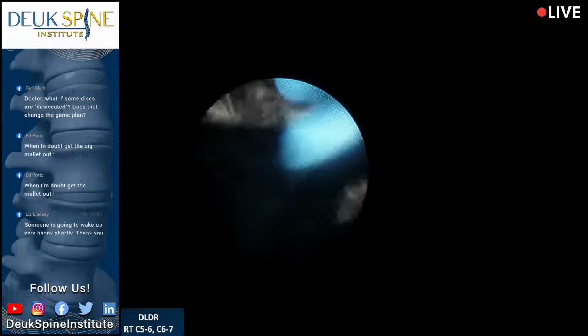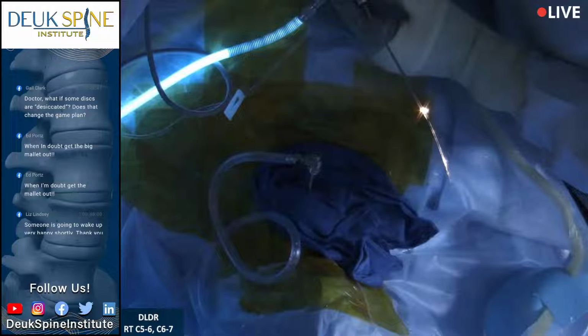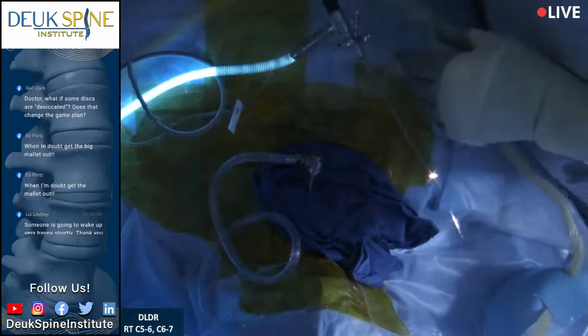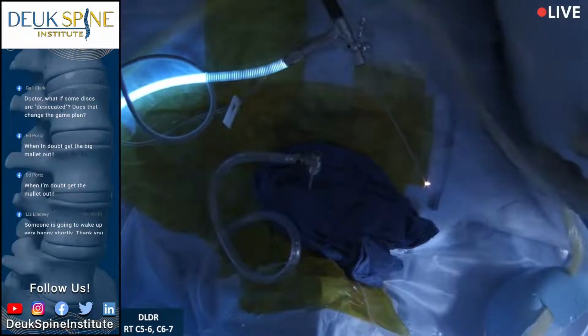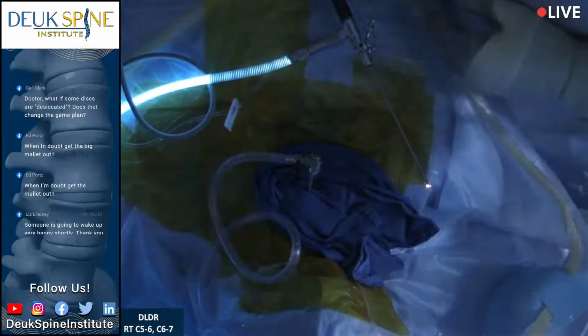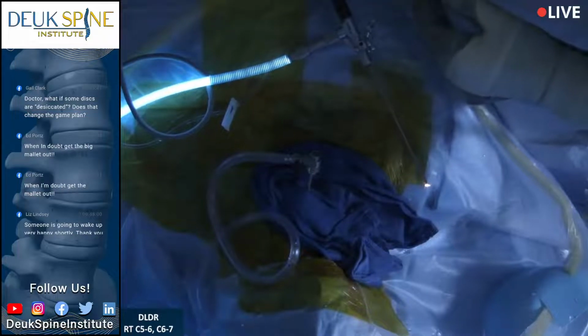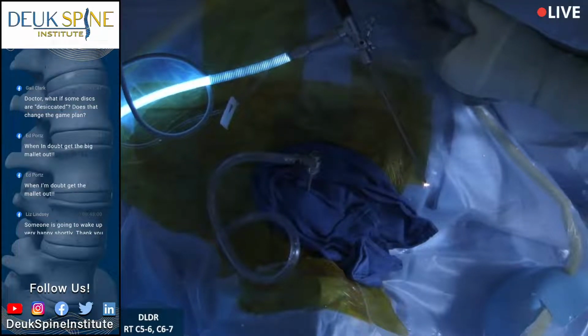Whoop, it did it again. You hear that? Same thing. I need another scope. Let's get another scope. Thank you, buddy. I'm sorry. Anything else, please? Thank you.